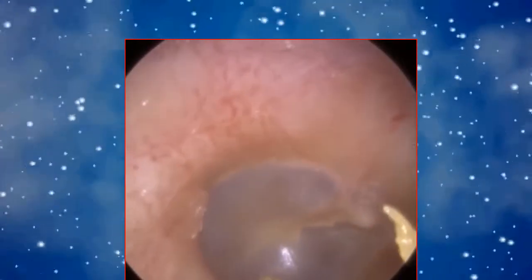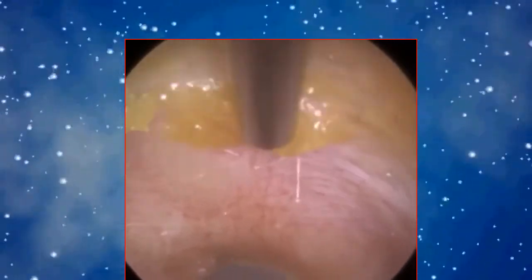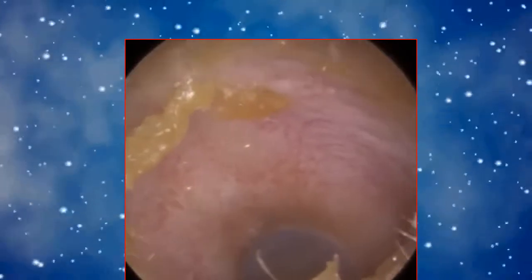So let me just explain what we're doing in the left ear. The left ear looked pretty healthy, but it just had this little piece of skin and wax on the drum. I removed it for the patient, just in case that was the cause of their occlusion. We did do a pressure test to see whether the patient's got a blocked eustachian tube on this side, and a tympanic retraction as a result, and that can cause occlusion, but they don't, although that can be intermittent. Therefore, as the patient attended, I thought, let's just try and remove that.